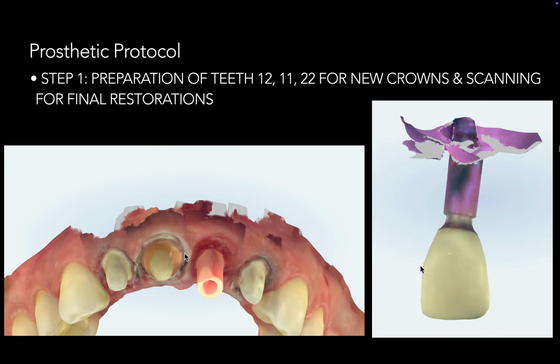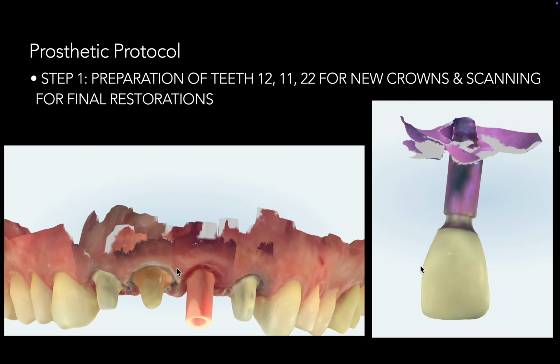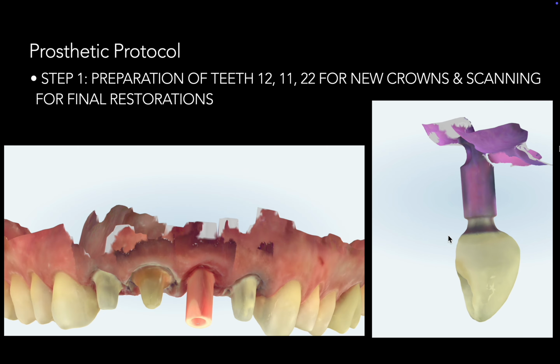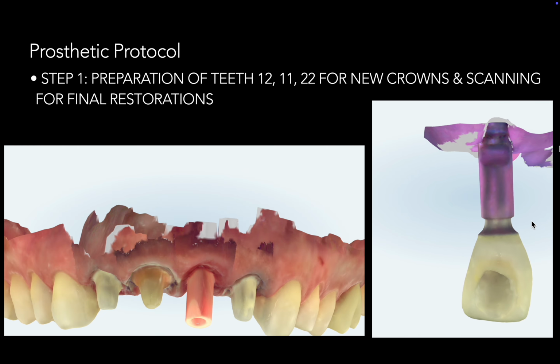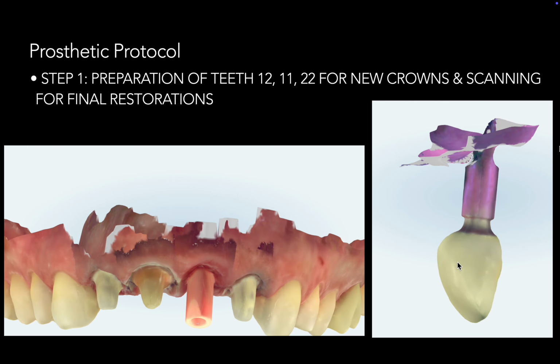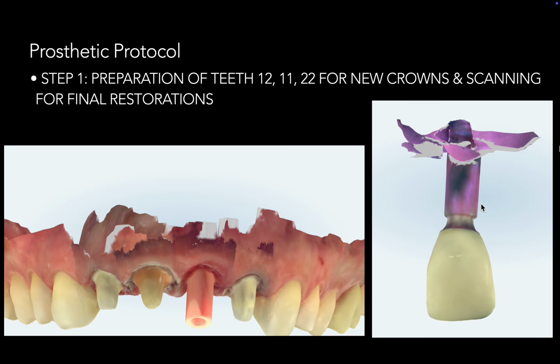And upon doing that, what I had also done, which is what I regularly tend to do for a lot of my cases, was to take a scan of my immediate temporary provisional that I had fabricated for the patient. And this is so that my lab can mimic those emergence profiles in my final implant supported restoration as well.